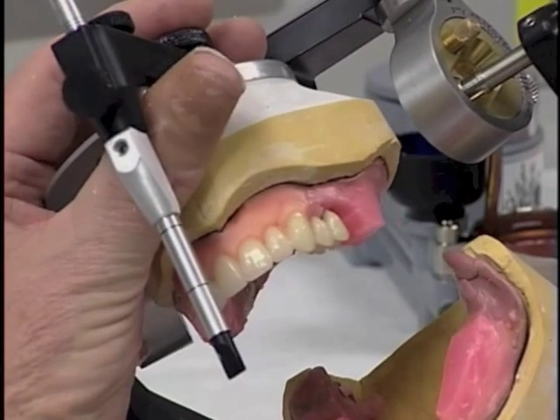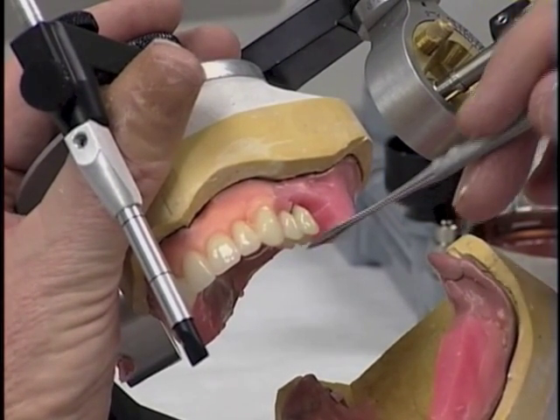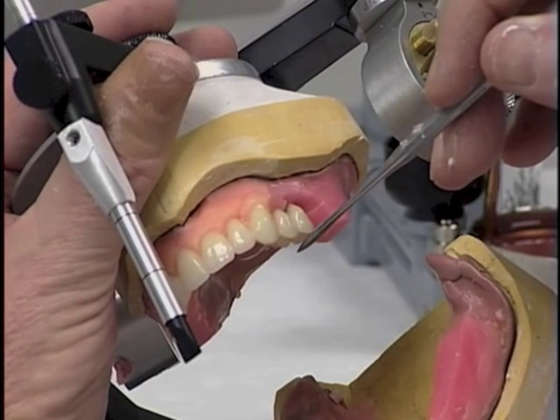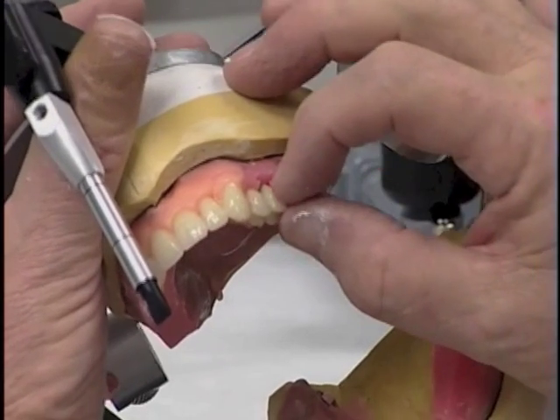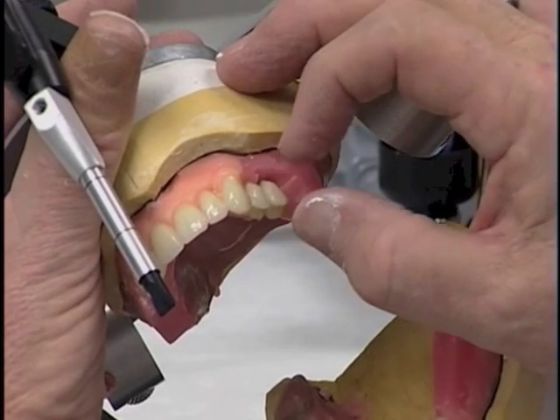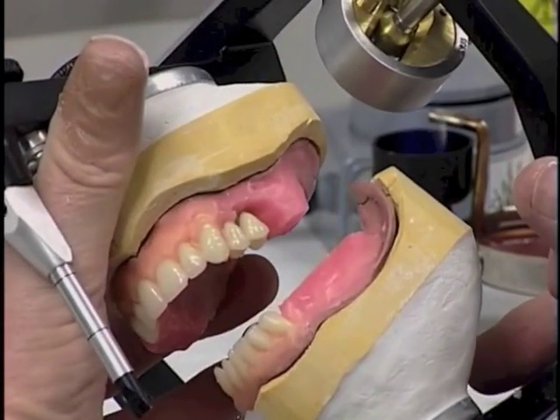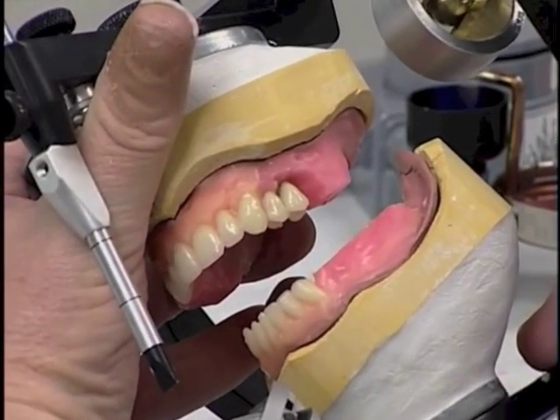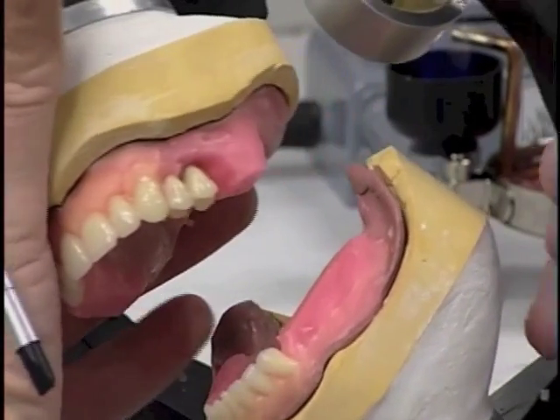And we do that by lowering the lingual cusp a little so that that lingual cusp hangs slightly lower than does the buccal cusp. Well, at this point, that's not quite there, in that the lingual cusp needs to come down just a little bit. So let's manipulate it so that the lingual cusp is down just a little. And we can see it's hanging just slightly lower than the buccal cusp.